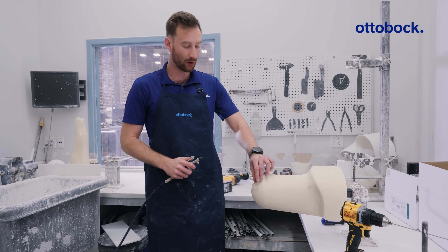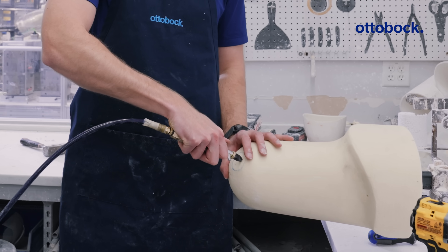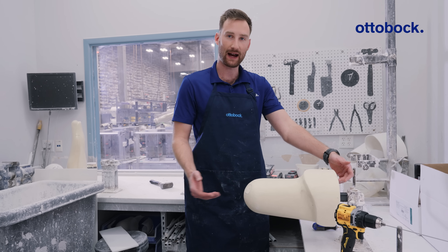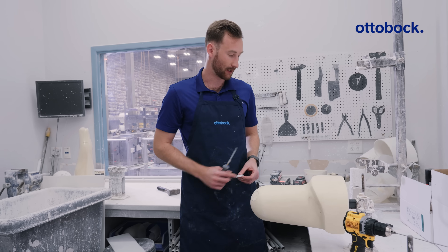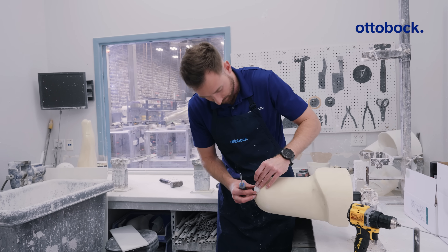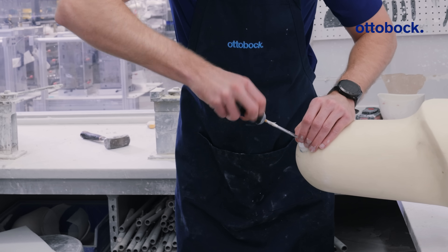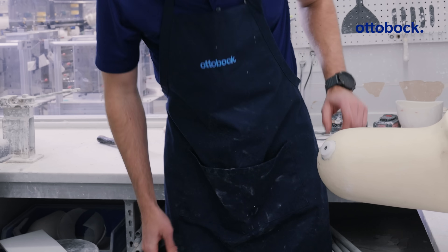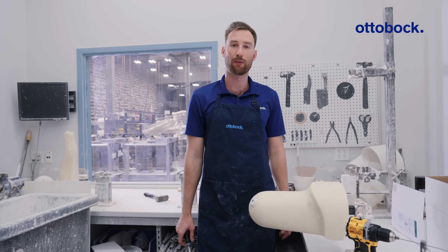After you drill the hole through the entire length of the positive model, it's important that you blow air to clear it out. Now that we have our hole drilled for a channel of vacuum when we make the test socket, it's time to attach the dummy. We have our marking where we're going to attach the dummy with the screw — put it right there, it matches our outline — and then I'm just going to screw it in. As you can see, our dummy is nice and flush against the mold and we're ready to pull our test socket.